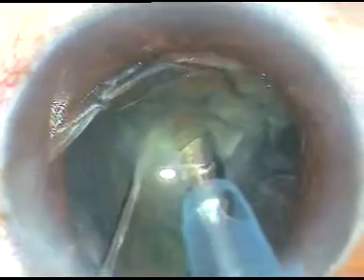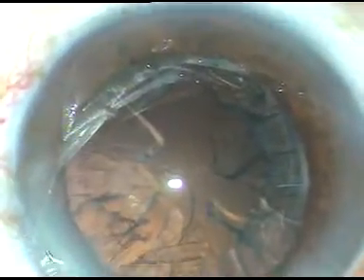In this case, the phaco power is 60 percent, flow rate is 45 ml per minute, vacuum is 450 mmHg — phacoemulsification settings. Settings are different in different machines. This is the last fragment. I come out and single-handedly manage the last fragment of the nucleus.